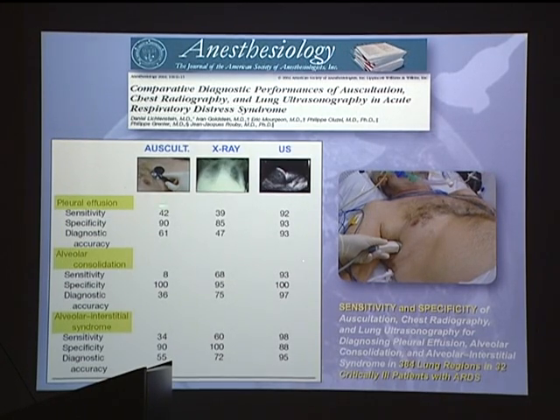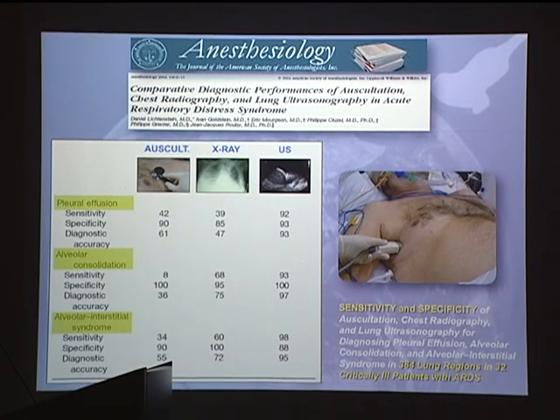For example, pleural effusion. You see from this number that if you, with a stethoscope or your clinical examination or the X-ray, say there is pleural effusion, you are usually right. So there are not a lot of false positives. Or for example, here you see pulmonary edema, or RDS, things like that. If with the X-ray or a clinical examination you say there is a pulmonary edema, you are usually right. So you don't need lung ultrasound to perform better in terms of specificity.